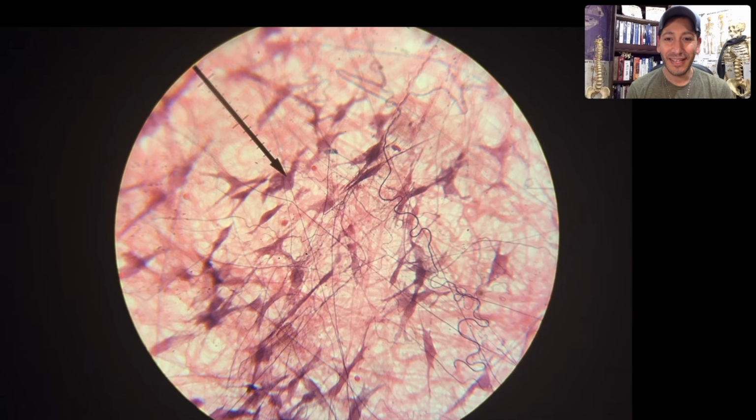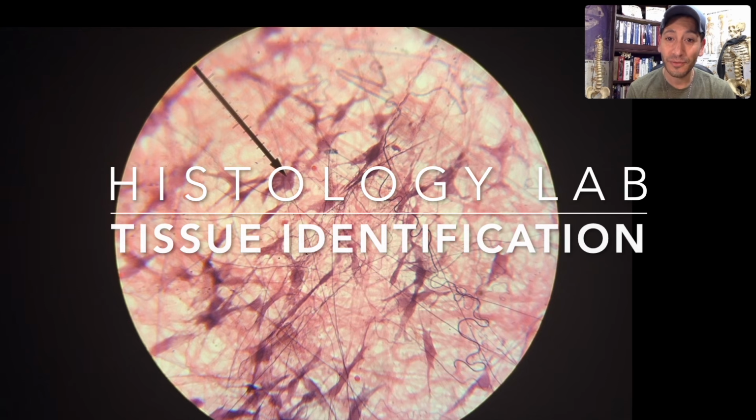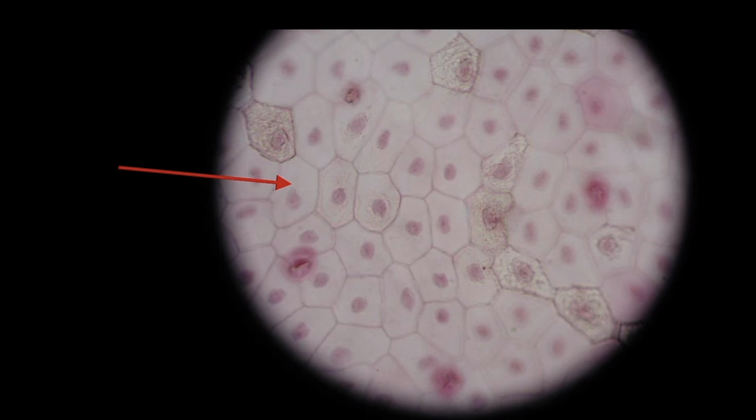Hey anatomists! In this video I'm going to show you how to recognize and identify each of the tissues of the body using photos of histological slides that I've compiled over the past 10 years, and I'll give you tips and tricks to identify these as well. And I'll also give you the location and function of each of these tissues, which could be clues for you on your lab practical, but they'll most likely also be lecture questions for this section as well. All right, let's get to it.